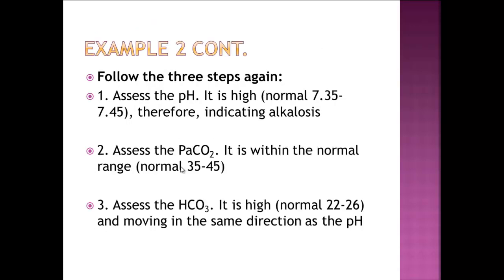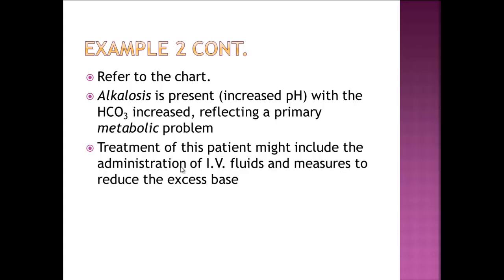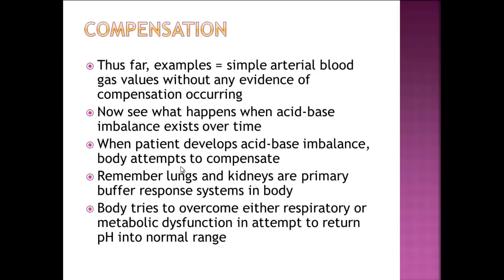And again, those are the steps you follow. We looked at the pH, looked at the PaCO2 and the bicarb HCO3 and found that indeed it was metabolic alkalosis. So the treatment of this person might include administering IV fluids and doing something that would reduce that excess bicarb in his system, okay?